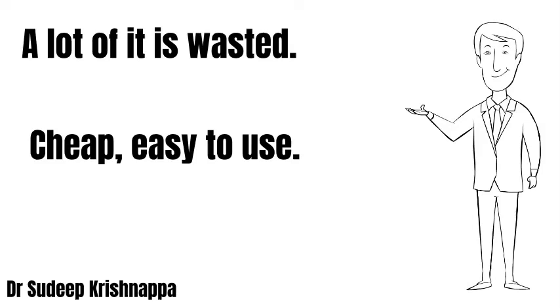Because of these variations, up to 30% of the medicine can get wasted, not reaching the lower airway. This can be overcome by using an ultrasound based nebulizer or a vibrating mesh nebulizer.